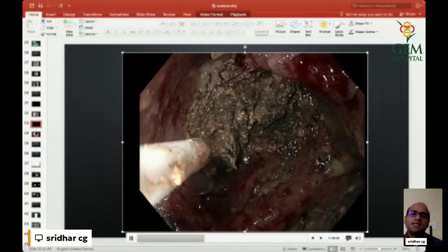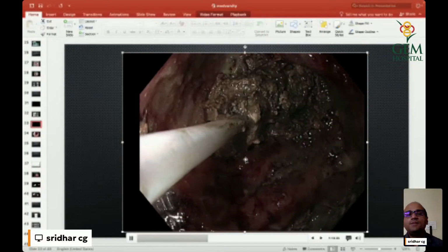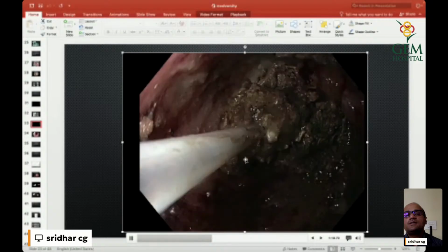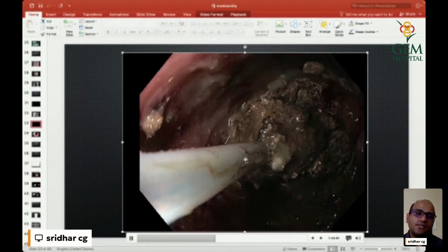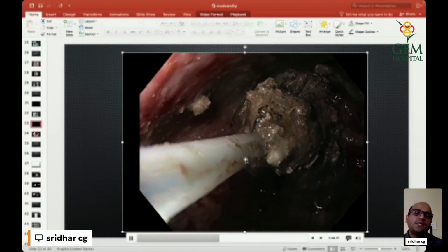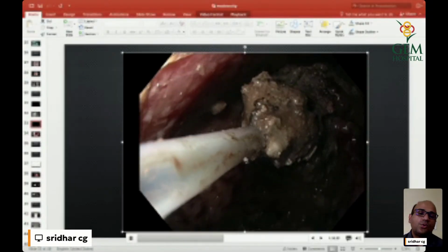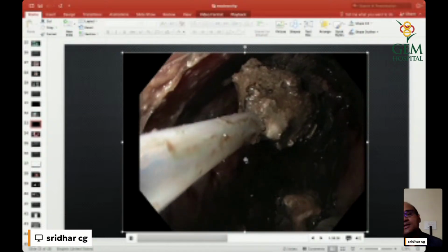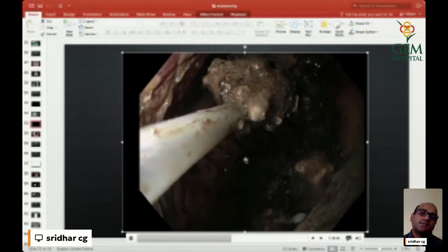Blunt dissection using the endoscope and the polyp snare tip helps in mobilizing the debris and avoiding unnecessary vital structures. So the debris is the target. We always try to jiggle the polyp snare a bit before just dragging the scope with the necrosector. It's always adherent to many of the things. So we jiggle like how you see, front and back. You can see a bit of movement and give way. So that is a sign that it's debris which has the hold, and you can see how beautifully it's coming out through the cavity. It needs to be a slow, steady process.